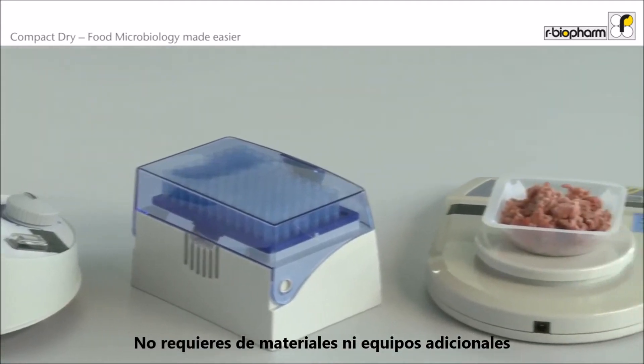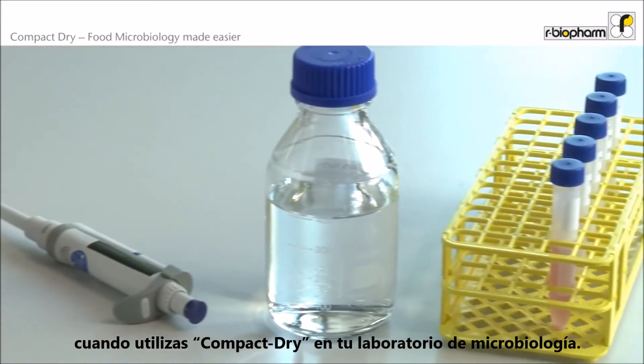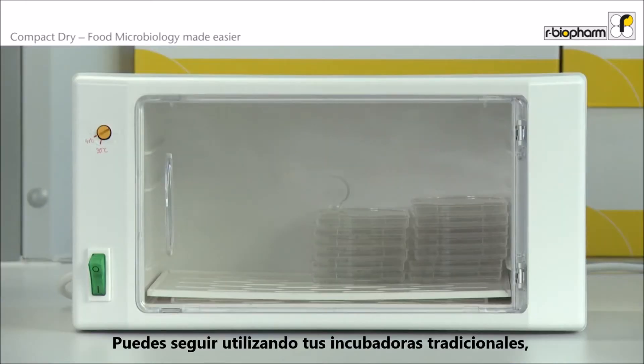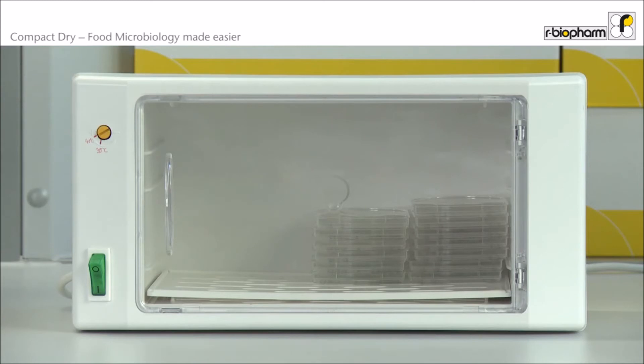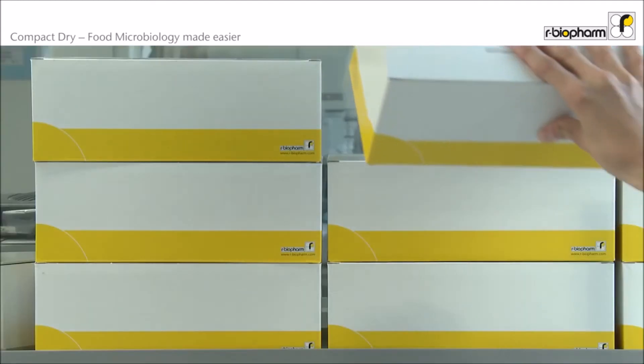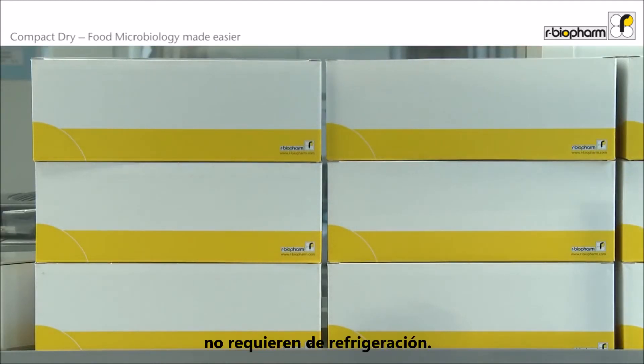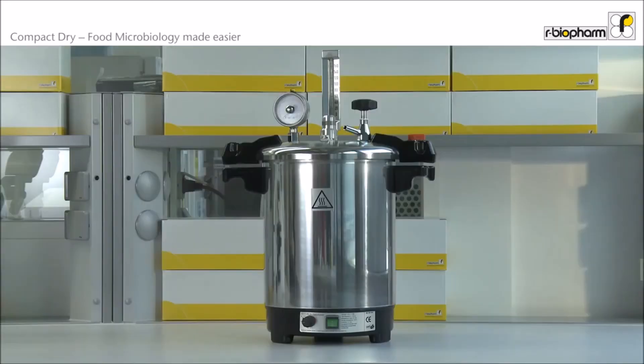There is no need for additional tools or equipment when using Compact Dry in your microbiology lab. You can continue to use your incubators; however, you will see you will save a lot of space compared to regular Petri dishes. Compact Dry can be stored at room temperature — there is no cooling needed during storage. For disposal of used Compact Dry plates, you can use a small autoclave.